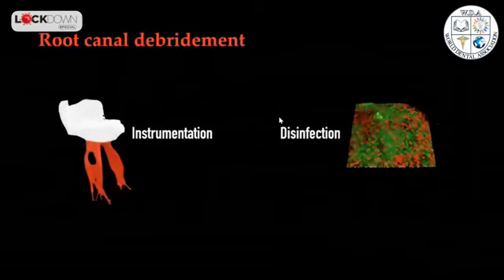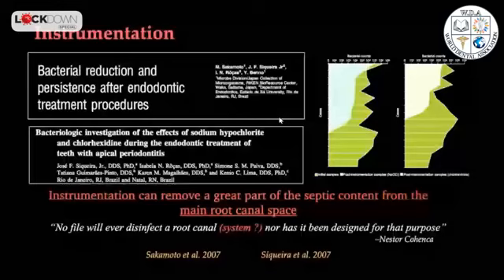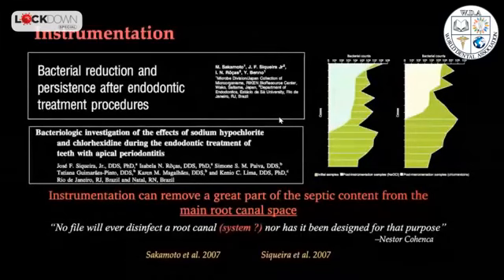And from the instrumentation perspective, it is well known that although the instruments alone, you can be using rotary instruments, reciprocating instruments, any kind of instrument, we know that when you instrument root canals, you can remove a lot of the septic content from the root canal space. This is from the main root canal space.